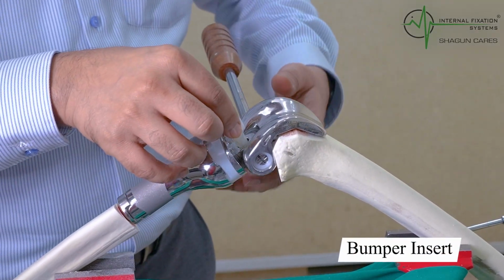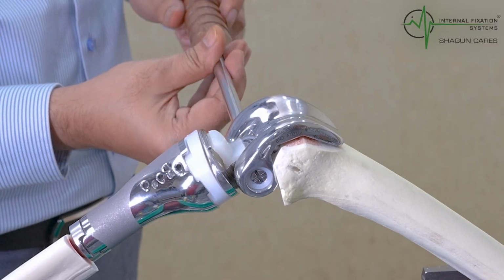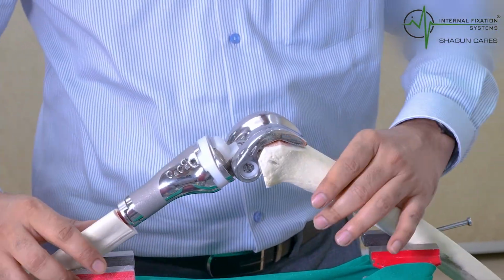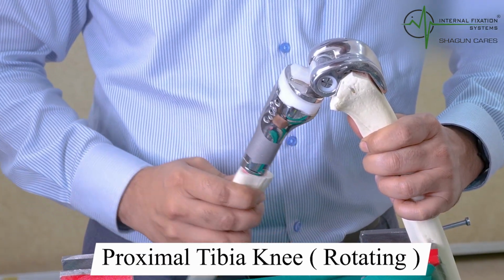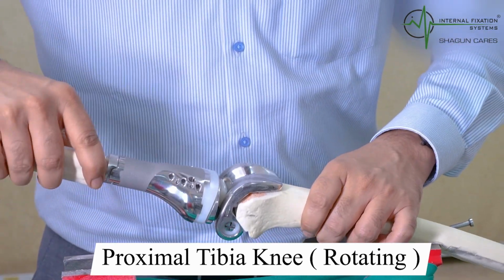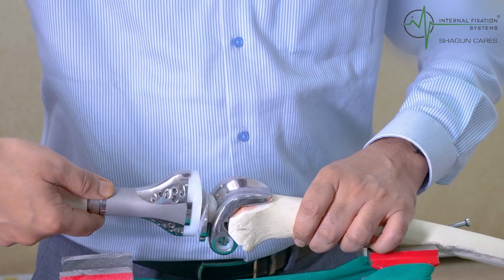This bumper goes inside and gives the locking, and now you take it out. This completes it, and now you see the complete flexion, extension, whatever you want. This is the complete knee extension, and you can see the rotatory movements happening there.